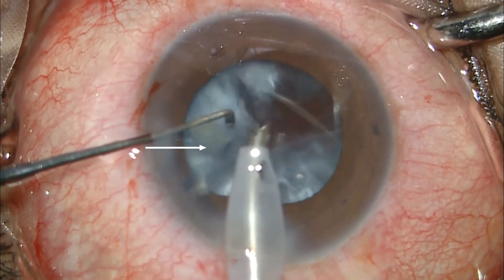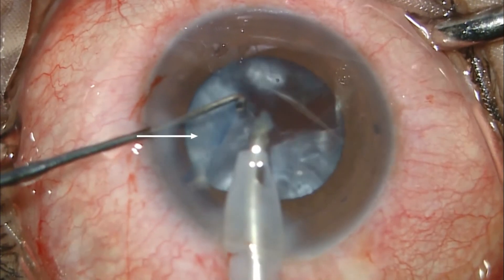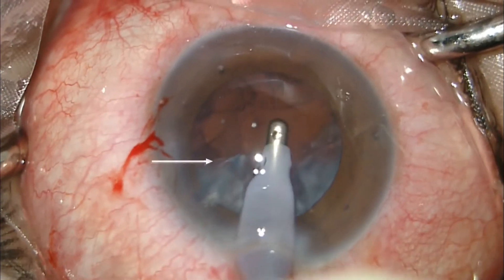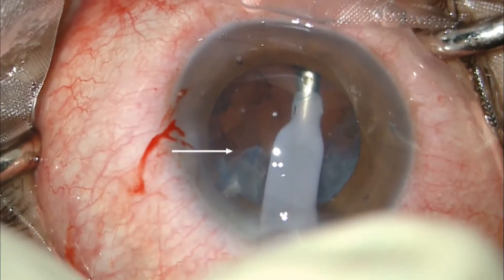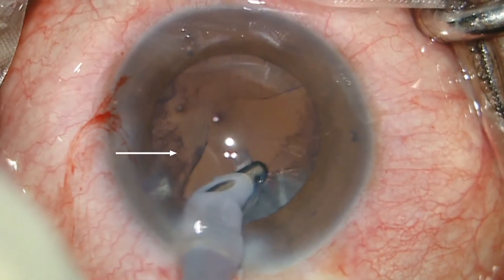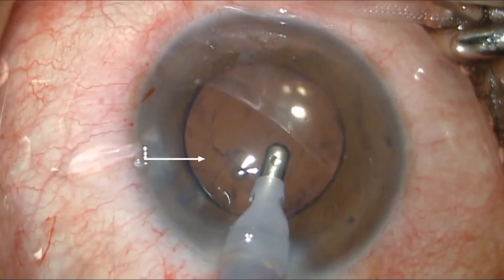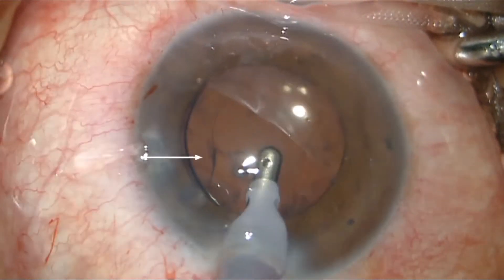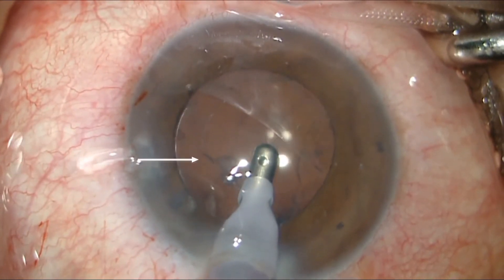Here, with the knowledge of the flap motility sign, the surgeon adds constant observation of flap motility sign to his surgical protocol. With the flap motility sign in the armamentarium, there is no dilemma and the surgery is successfully completed.